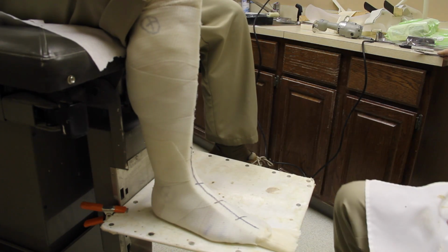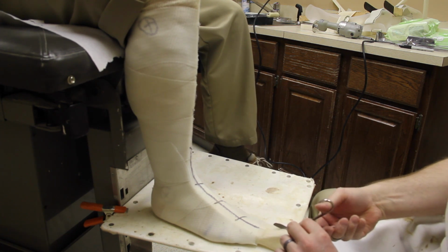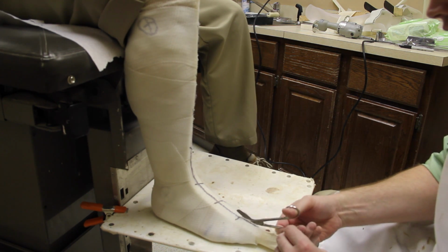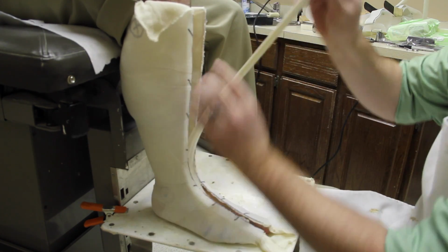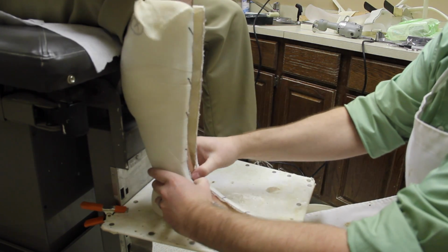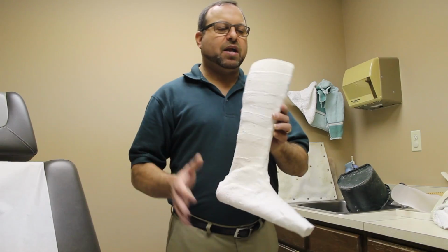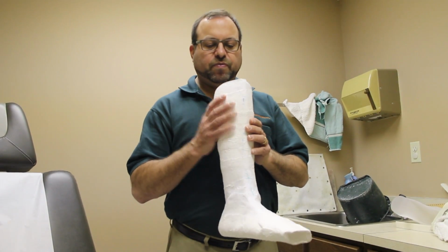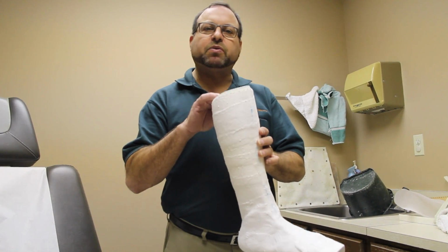Now that we've cut through the fiberglass, we'll just trim the stockinette and peel the cast off. And then just pull our leg out. Now we've sealed the cast, we've wrapped it with plaster so it won't leak. We'll fill it with liquid plaster, which will be the next step.